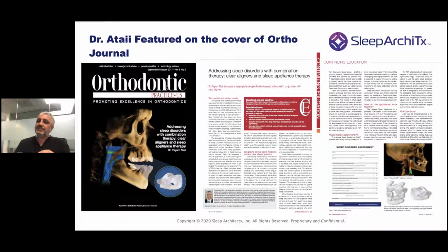Remember, CBCT is not for you to use as a treatment plan or a diagnosis. It's a visual, just like an x-ray. You would look at whether or not your crown margin is sealed or open. Am I able to visualize an airway or is it closed? Because what happens when the patient lays flat on their back? Potentially that blue airway you see on the cover of the magazine could be blocked.